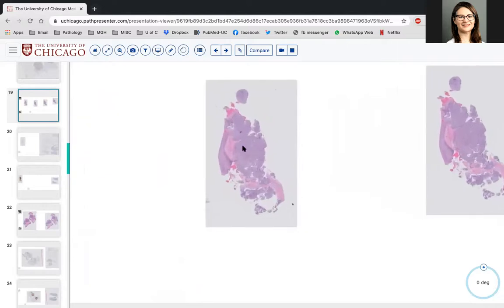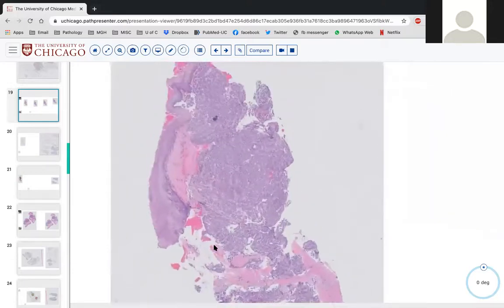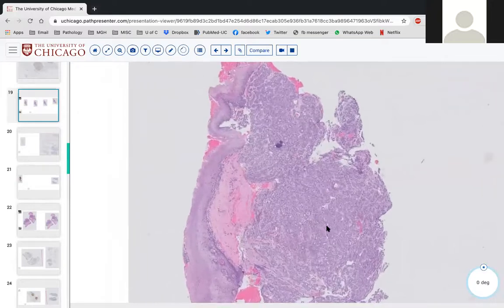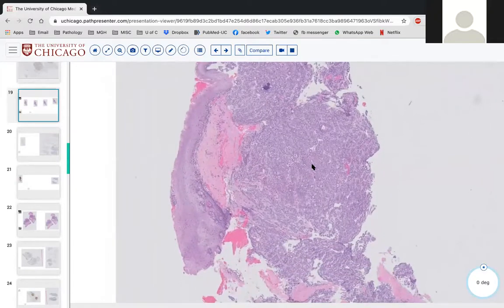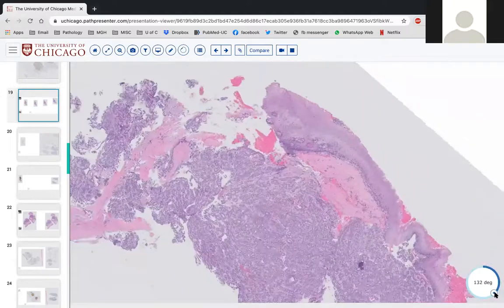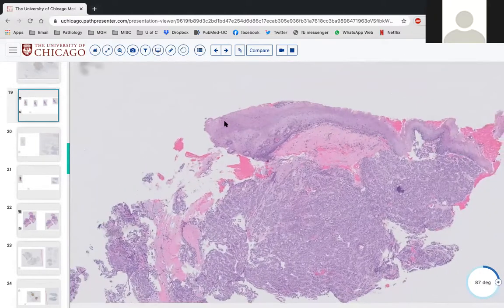All right. So this is on a little bit of a delay, but I think that we can get through it. So this patient was an 89-year-old female with a nodule of the retromolar pad. Does somebody want to describe what we're seeing? Do you mind spinning it so the squamous epithelium is on top? Not to be picky or anything. I can give it a shot.